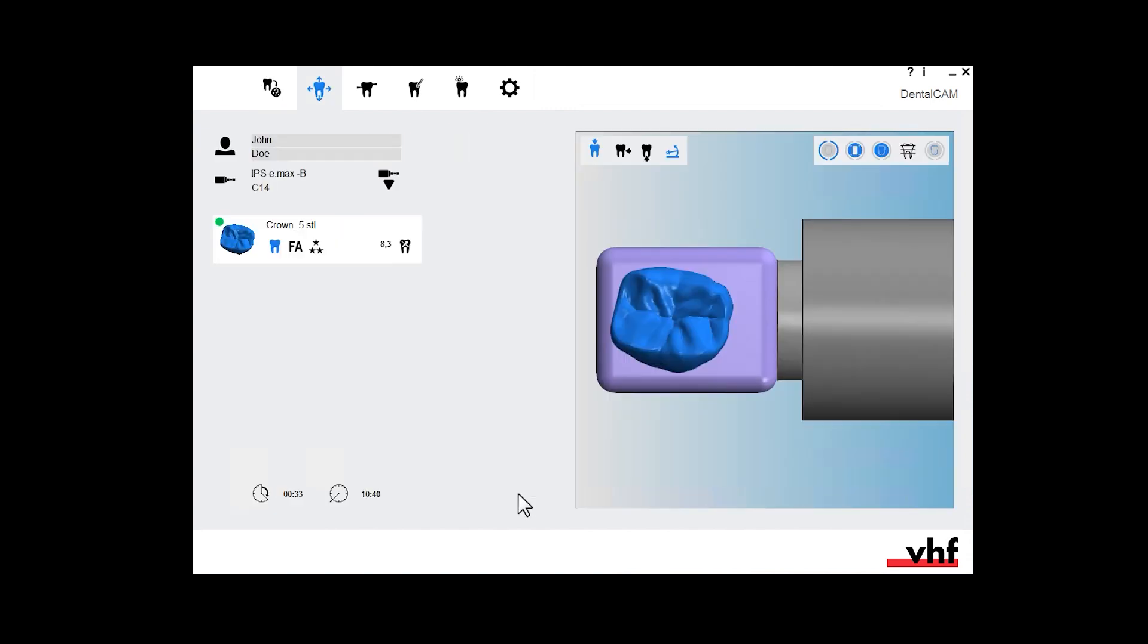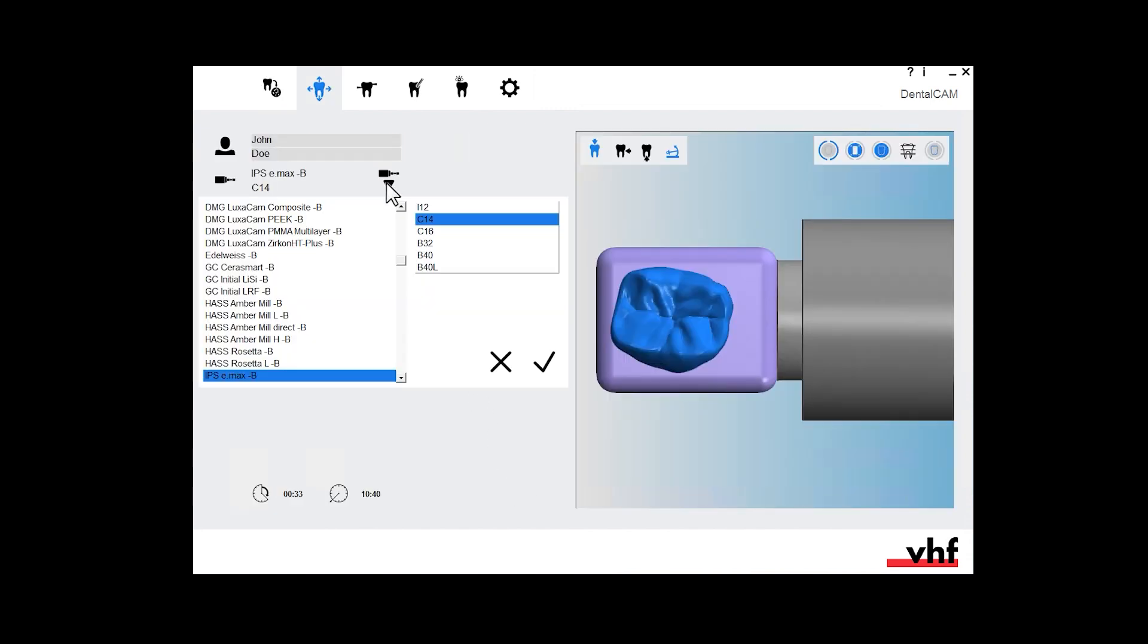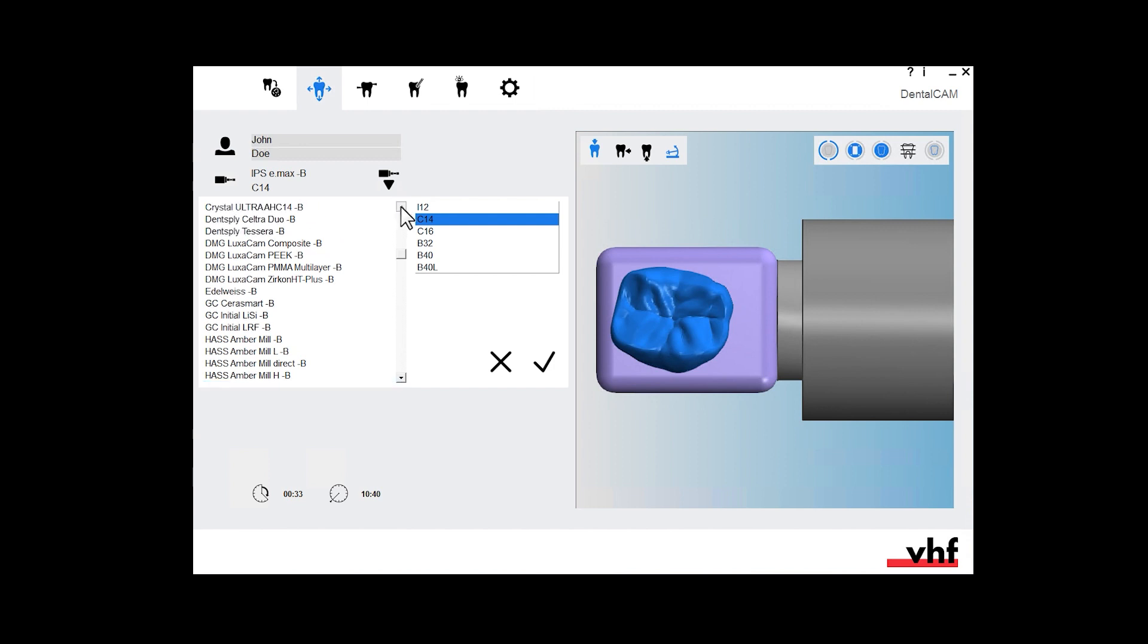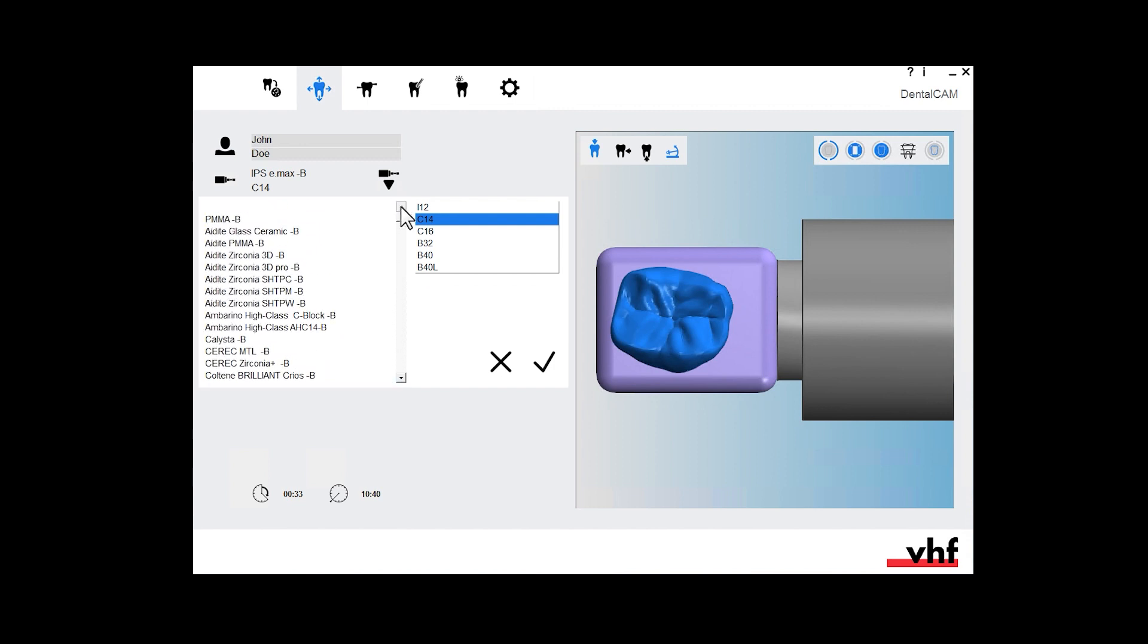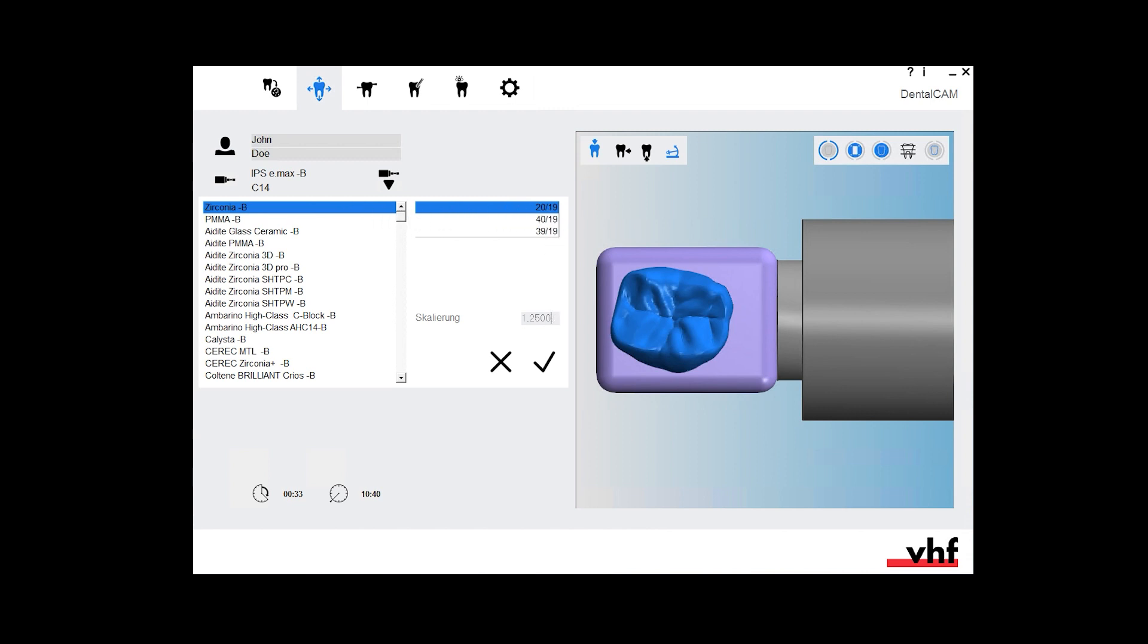The nesting view opens. Select the block material and size. If required, correct or confirm the scaling factor.